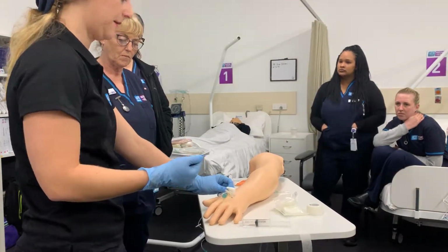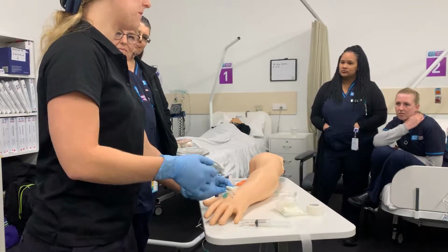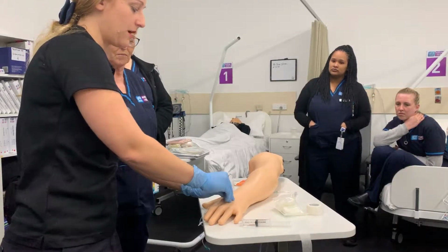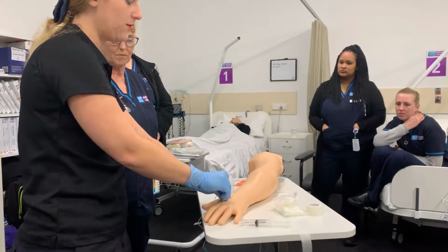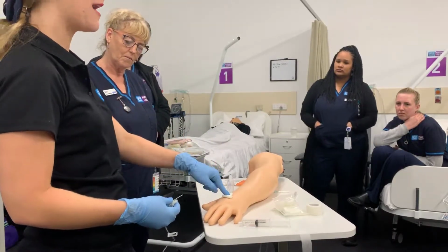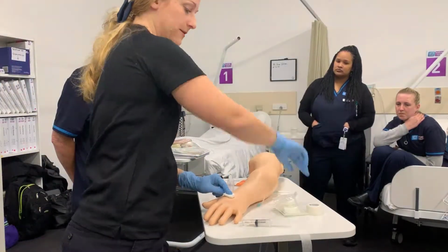And now I kind of prep it so I'm ready to tip it onto the site as I pull the cannula out, okay? Good nurses pride themselves on not spilling a single drop of blood. If you do spill blood, not the end of the world, you just might have a mess to clean up, okay? So, hold the gauze there, gather up all my tape and the cannula, and as I pull it out, put the gauze down, cannula's still in, and I keep pulling, and now I hold pressure. And I have to make sure my finger's right on that site, because if I'm slightly off, blood will be coming out, okay? Hold pressure.